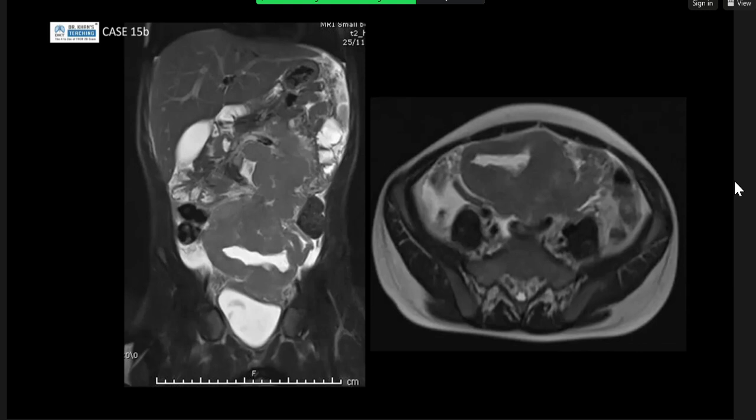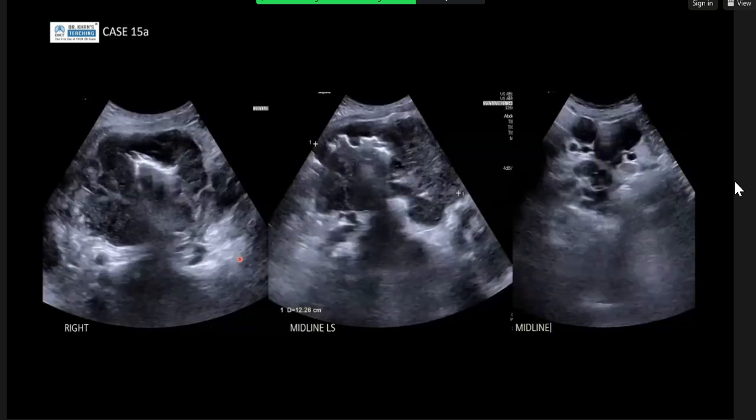Yeah, so often these ones are a lot easier when you are scanning. This is a patient that I scanned, and when I looked at it, I thought exactly what you thought, aneurysmal dilatation, and you could see that there was passage of bowel contents through here, which you can't really capture very well on still images.